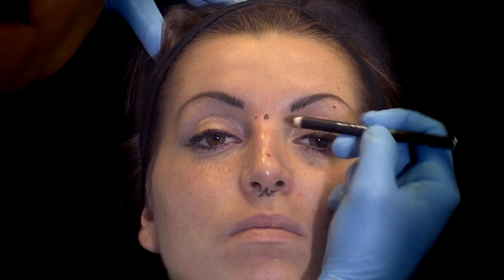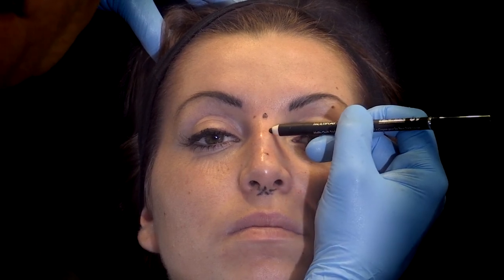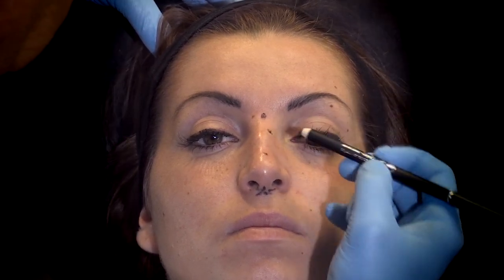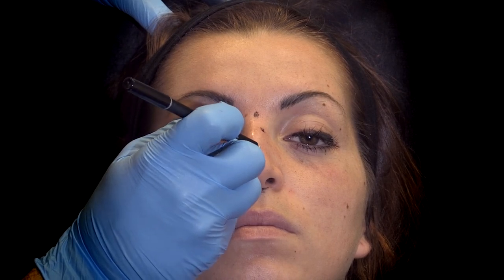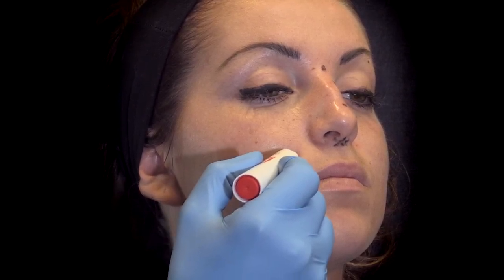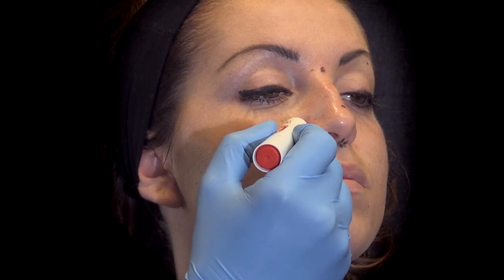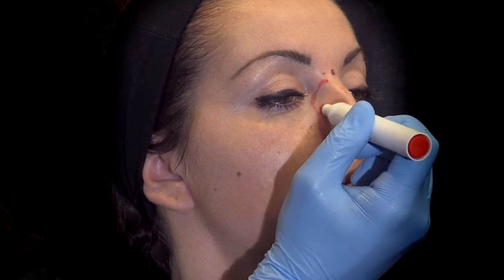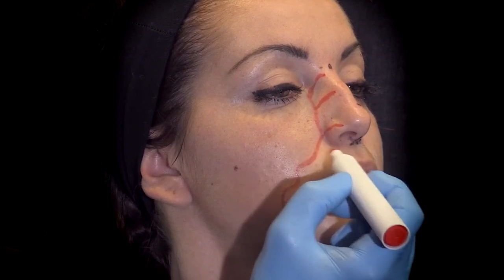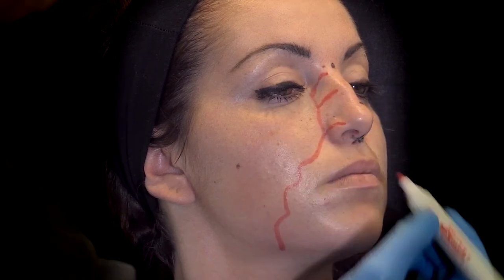That will be my entry points, 1, 2, 3, and 4, to safely inject the nose on an area where we have fewer vessels and no big vessels. The facial artery runs under the nasolabial fold and then on the lateral part of the nose, ending with the angular artery and giving some branches on the nose and the nostrils.